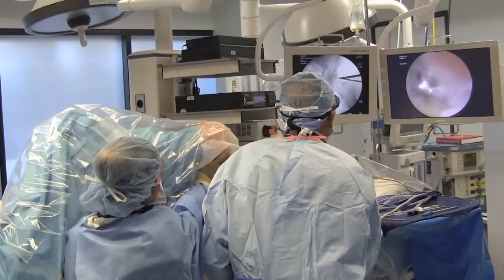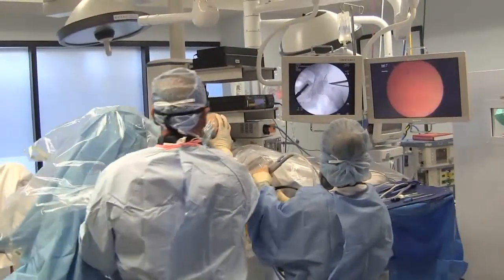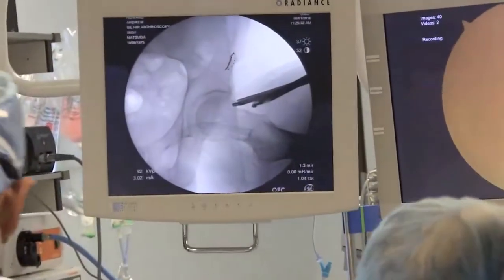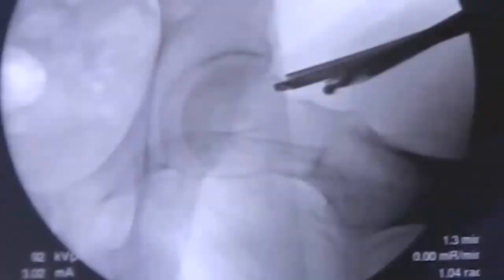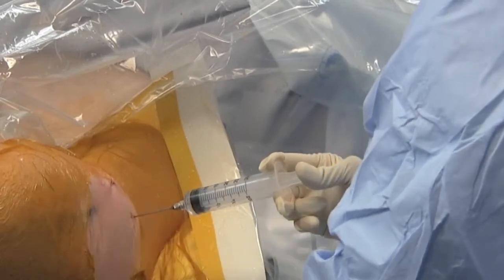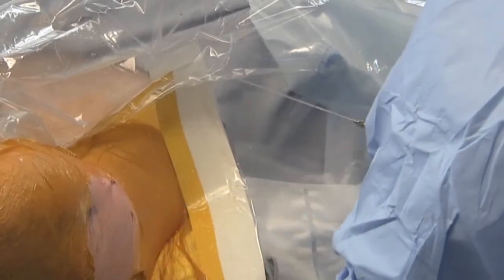Once dynamic testing confirms eradication of ongoing impingement and fluoroscopic modified dunlateral view confirms restoration of anterior offset, the hip is injected with ropivacaine and morphine, followed by routine closure and dressing.